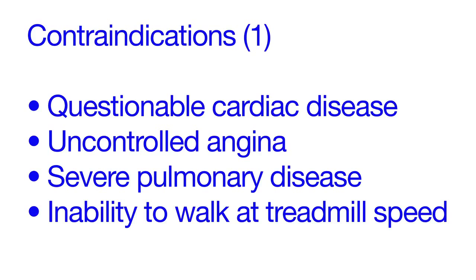Although this test is not as rigorous as a cardiac stress test, and the risk of cardiac complications is small, it is appropriate that a written protocol be established and followed with regard to exercise contraindications, methods, and response to cardiac emergency. EKG monitoring should be used if available.